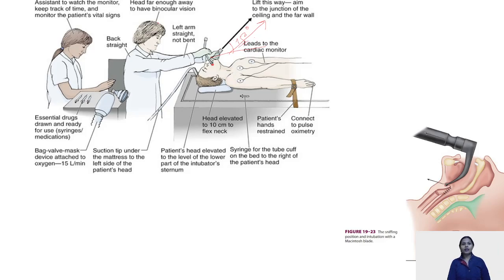And the force is exerted via your triceps and your deltoid. These all are the questions that are asked: at an angle of 45 degrees away from you towards the ceiling, and the force has to be from your deltoid and your triceps.